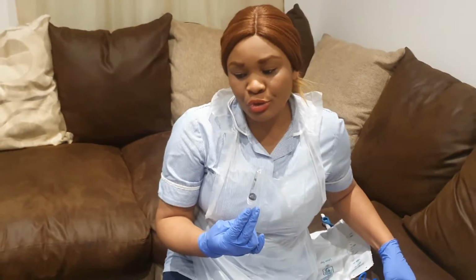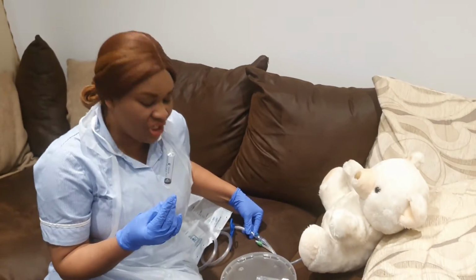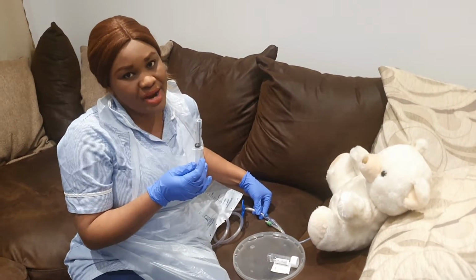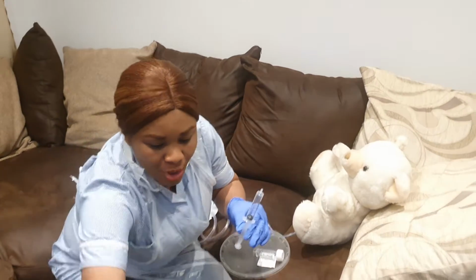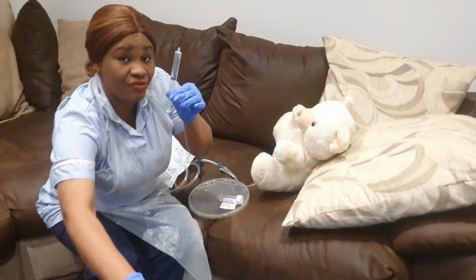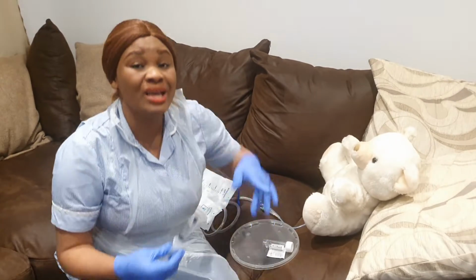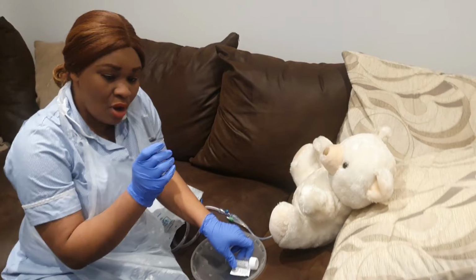So all I need you to do, when you're holding the syringe, sometimes your hand can be shaking, all right? It's not actually easy. Your hand can be shaking, and sometimes you see the urine pouring. Don't worry, guys. It's just natural in your OSCE exam, because probably you are anxious. So I got a prefilled syringe here already, because obviously there is no urine in the catheter. On your exam day, you will draw 10 mils. So this is now the 10 mils of urine.